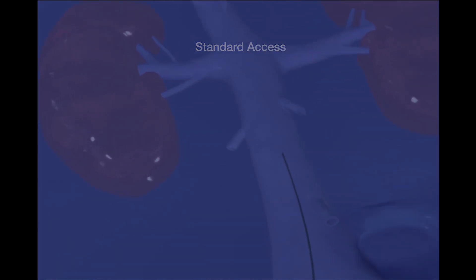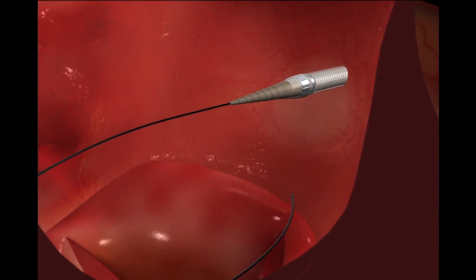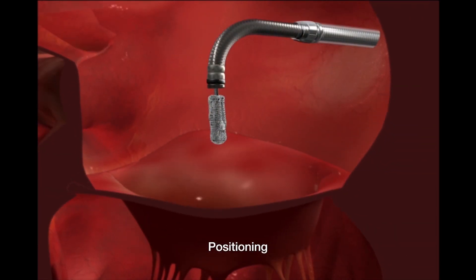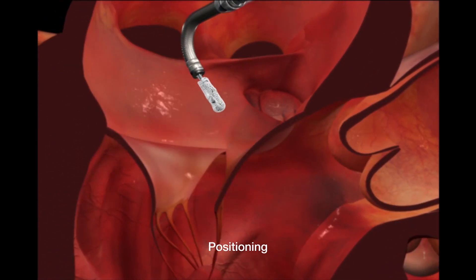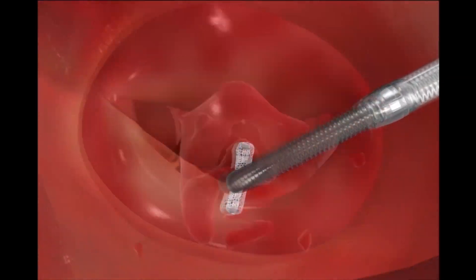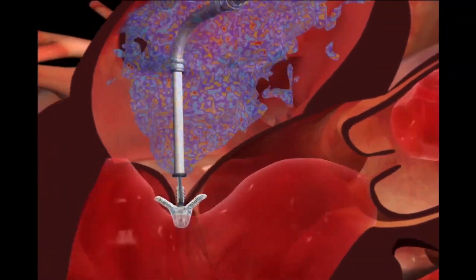We have to puncture the wall between the two upper chambers and insert this guiding catheter into the left atrium. And once we have the guiding catheter in place, then we put the clip delivery system into the left atrium. Once we get it positioned in the area where the leaflets are coming together, we can maneuver it back and forth in actually 11 different directions in order to get the clip precisely in the middle of the two leaflets.